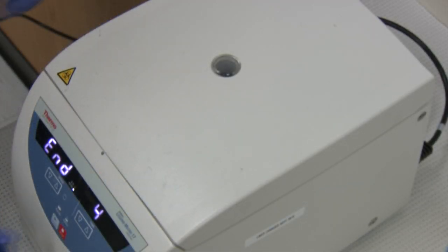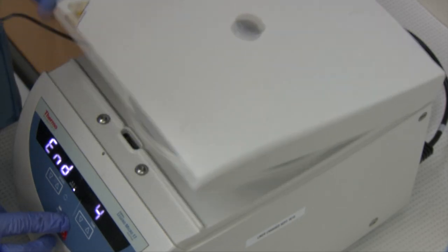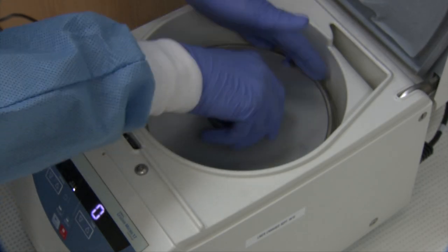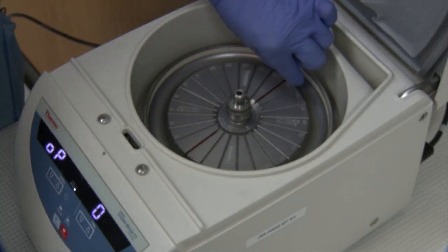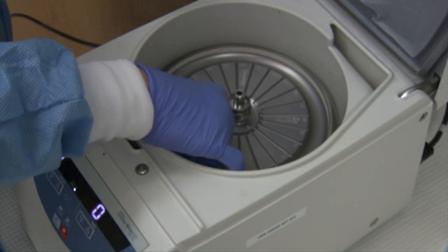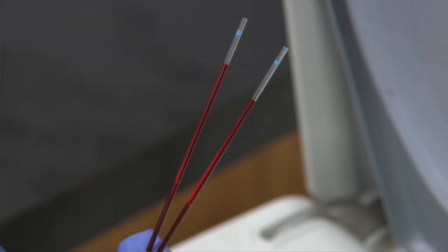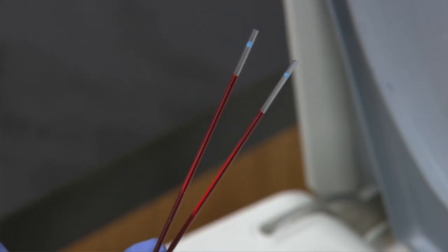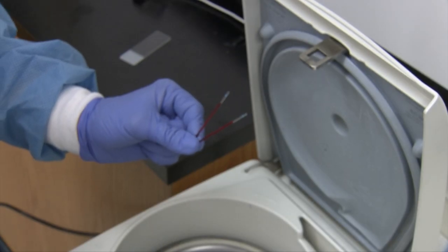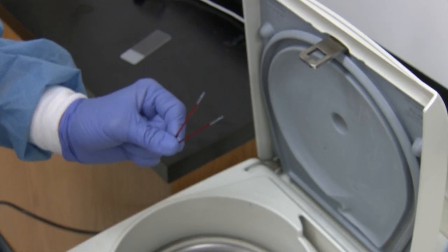Once the time has elapsed, we open the lid, remove the cover plate, and we have our spun samples inside. These ones are obviously quite hemolyzed. You always want to review your plasma color when you take them out of the centrifuge.